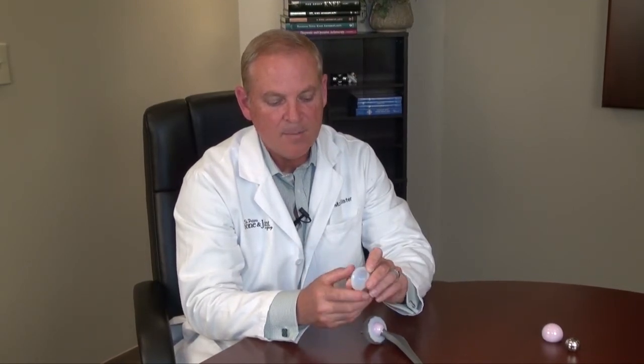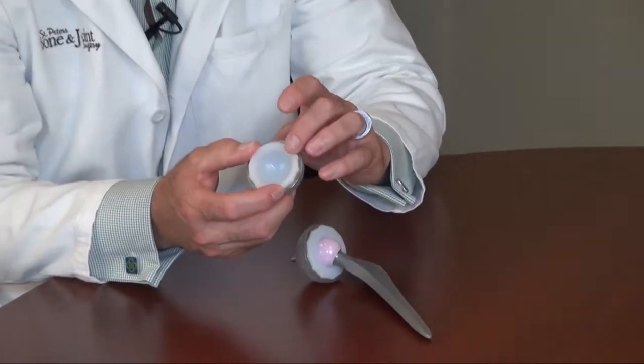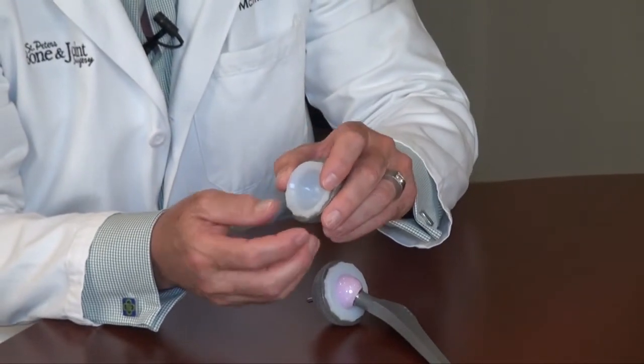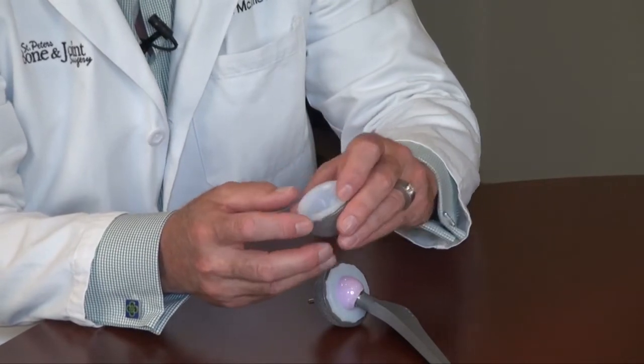This is made of a high molecular weight polyethylene that's been cross-linked, and now these hip replacements, because of this change in plastic, may be able to last 30 or 40 years, whereas the old hip replacements would often begin to wear out by about 15 years.